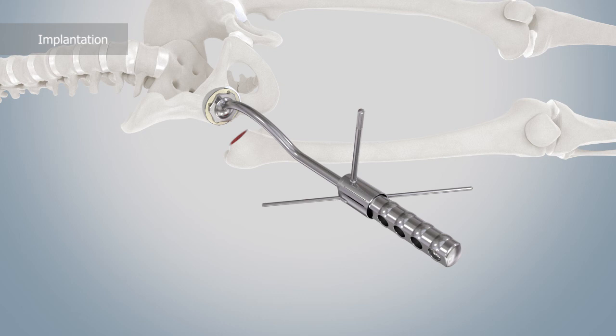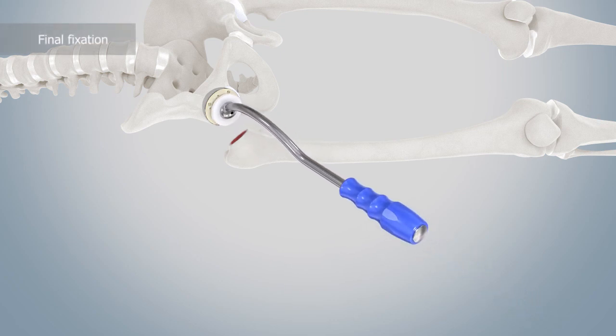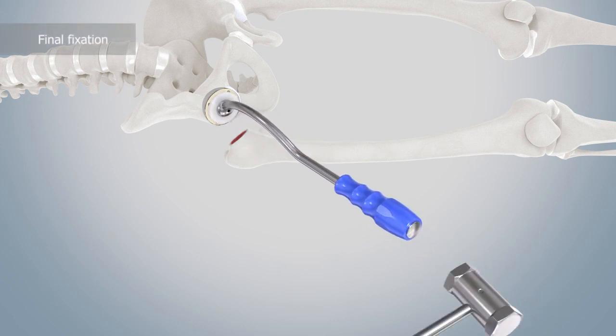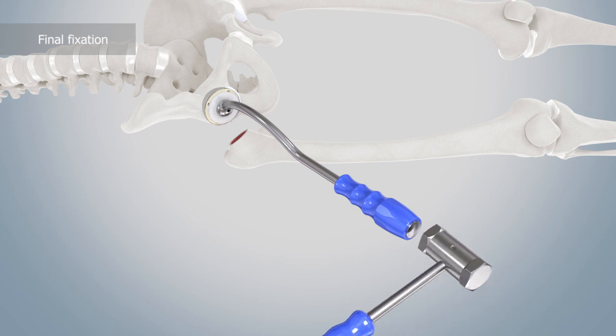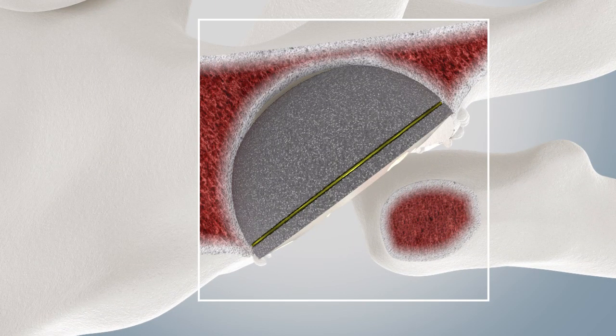The RM Pressfit cup has a rather soft, sometimes even springy impact behavior. The RM Pressfit cup literally sucks itself into an acetabulum whose bone has been optimally prepared. Easy detachment of the impactor. The final press fit of the cup can be further consolidated by use of the post-impactor. Press fit in the area of the cup equator.